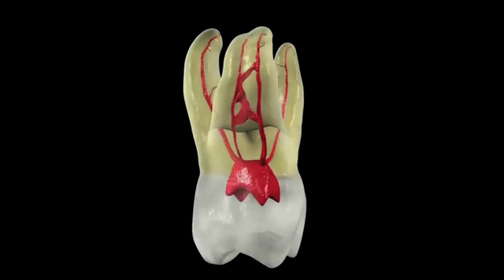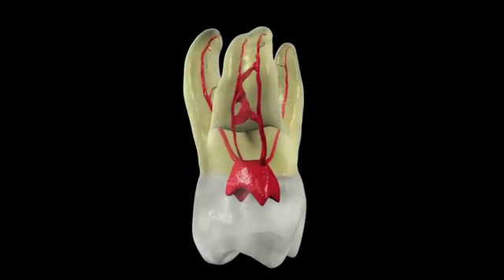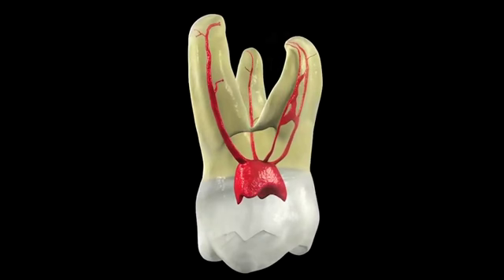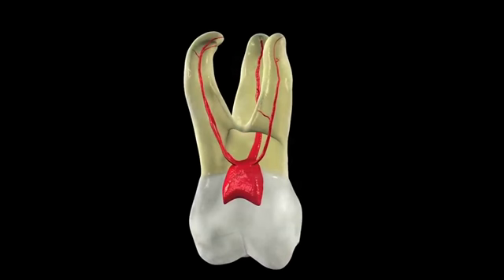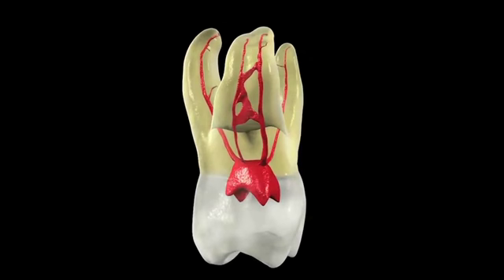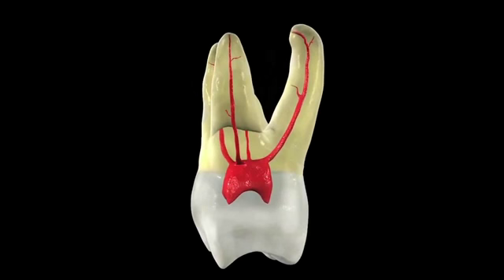Today's episode on canal preparation will be conducted on this maxillary animated molar. We're using an animated molar so we can clearly see the work done inside the canal — dentinal debris, mud, how shaping progresses right down to the final preparation. The maxillary molar is the most frequently researched tooth in the mouth, the largest by volume, but probably the most misunderstood, leading to many misunderstandings during endodontic treatment.